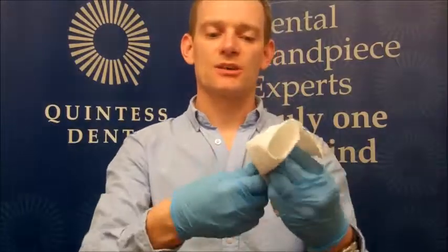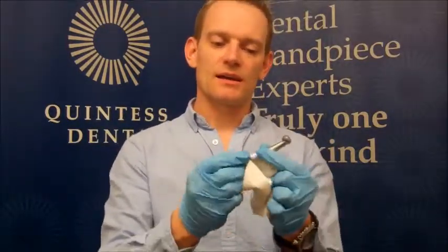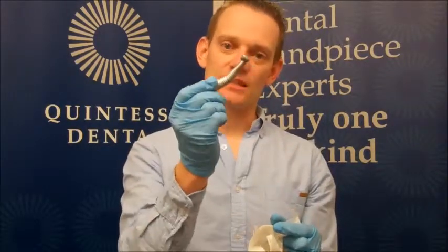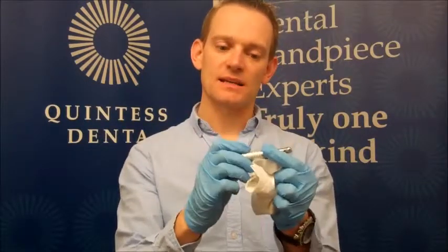Clean off the excess oil, and it's a good idea after that to run the handpiece up to get rid of any excess oil contained within the handpiece itself. And that's basically it.